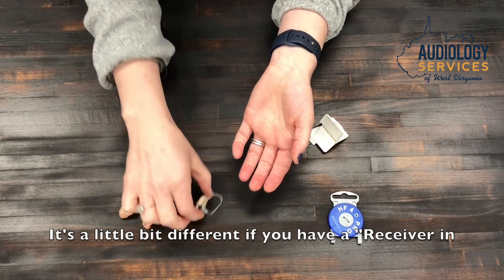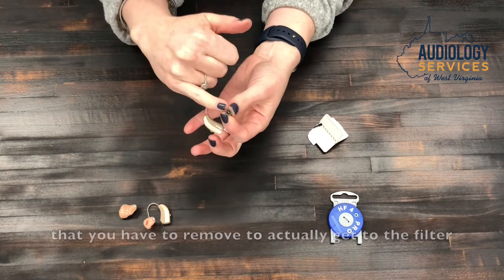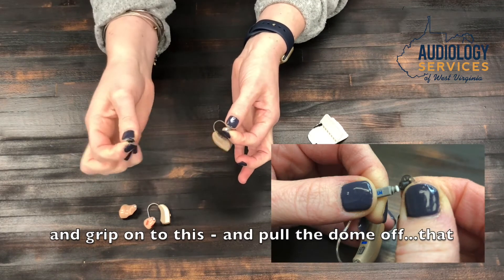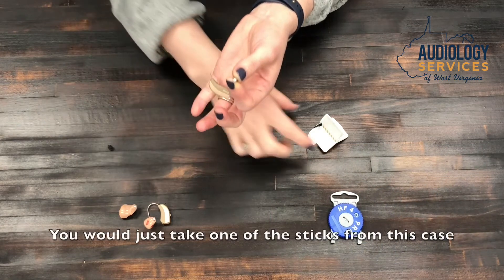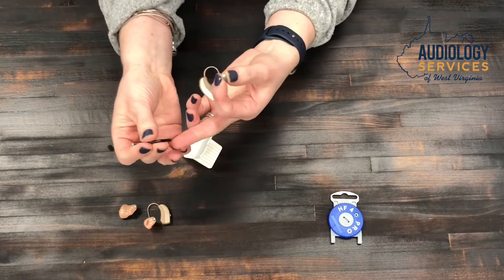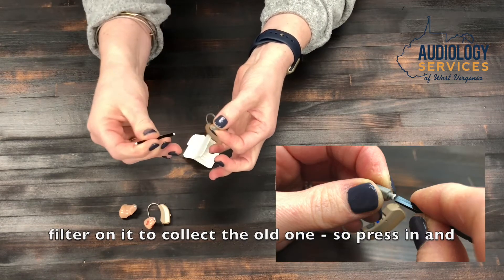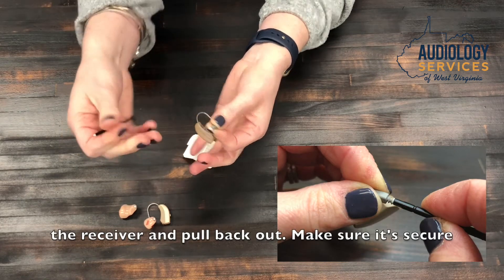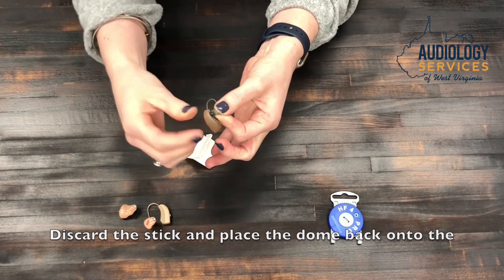It's a little different if you have a receiver-in-the-canal hearing aid that does not have a custom ear mold on the end. In that case there's a dome that you have to remove to get to the filter. Take your fingers, grip the dome, and pull it off — that exposes the filter. From here the steps are the same: use the blank end of a stick to collect the old filter by pressing in and pulling out, turn it over, press the new filter into the receiver and pull back out, make sure it's secure, discard the stick, and then place the dome back onto the receiver.